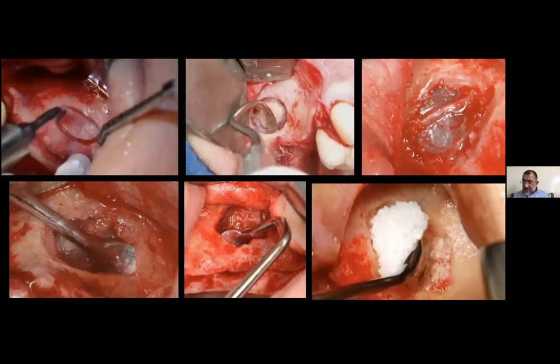And as everybody knows, this lateral approach technique of sinus lifting is used worldwide by 90% of practitioners. But when I show you the Prof Sohn technique, I am sure that you are going to use this technique in the maximum of your surgeries, because it's so much easier than the lateral approach. You can see here that you can open your window and elevate your membrane with a mechanical instrument or a piezo-surgery instrument, and you can individualize the artery and put your bone into the sinus.